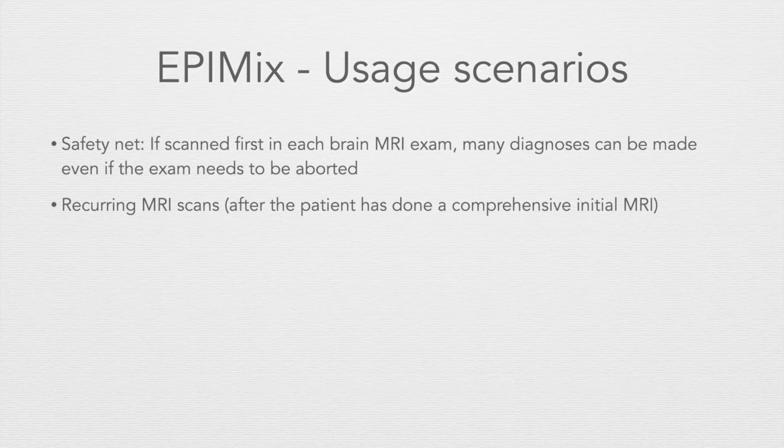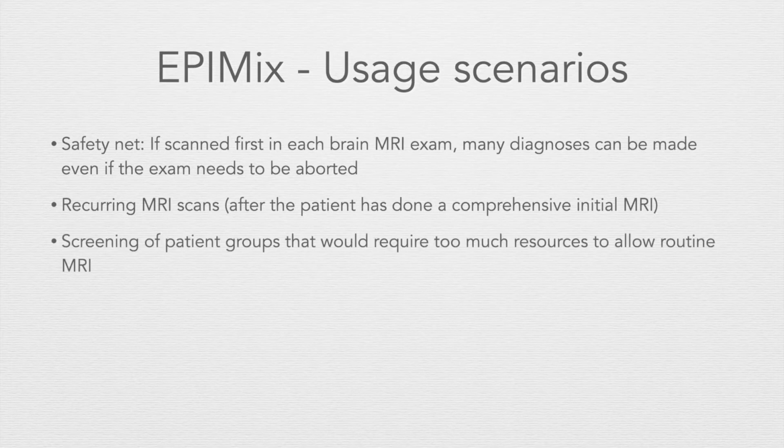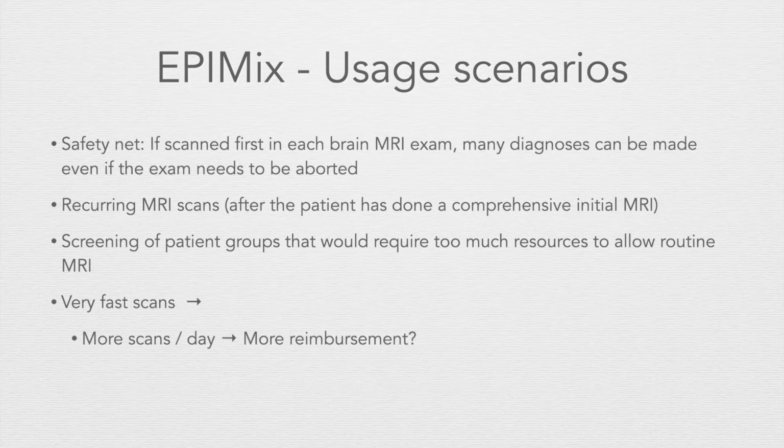And also you can think of screening of patient groups that will require too much resources to allow a routine MRI. The thing though, with very fast scans, just in general, if you allow very fast scan to be done at a hospital, that will give you naturally more scans in a given day. And maybe that's a good thing.